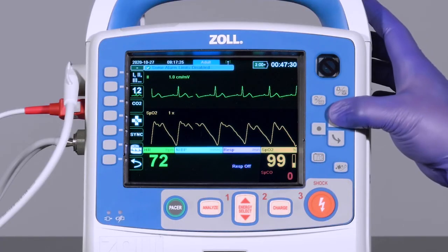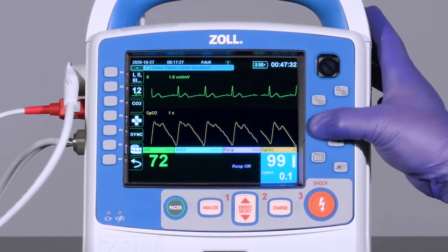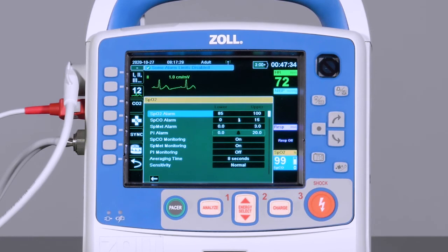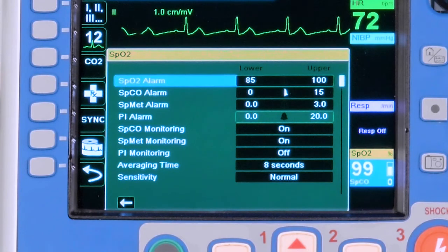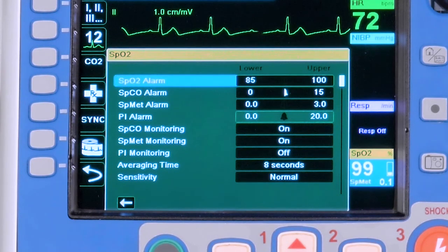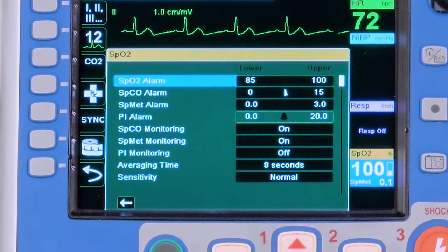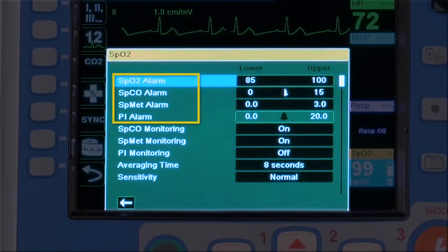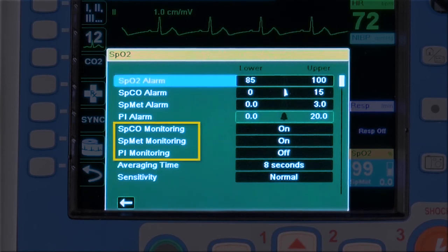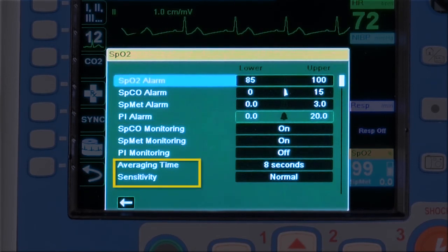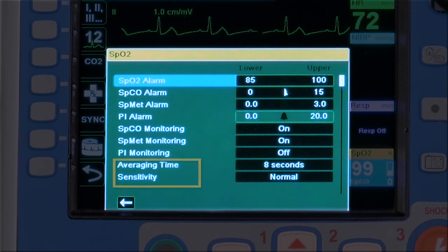Use the navigation keys to highlight and select the SpO2 numeric display to open the SpO2 parameter control panel, where you can select options that optimize the use of pulse oximetry for the patient. In the control panel, the provider has the ability to enable and disable alarms, enable and disable available parameters, and adjust sensitivity and averaging times.